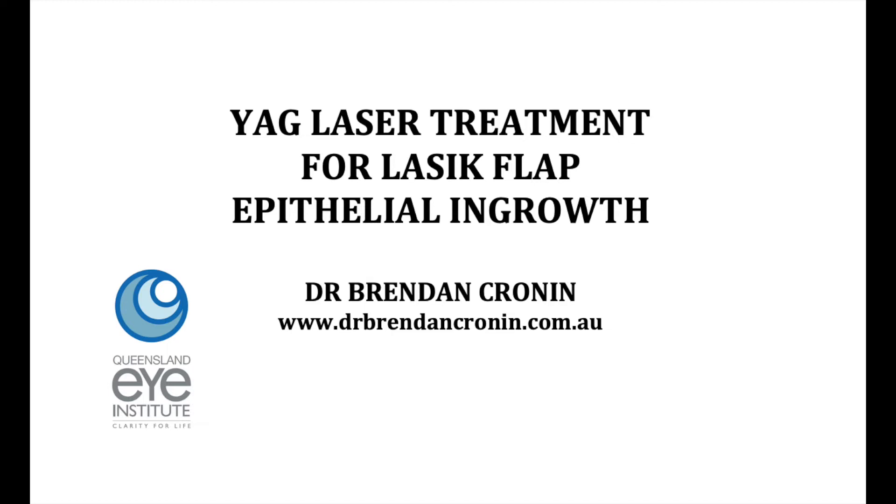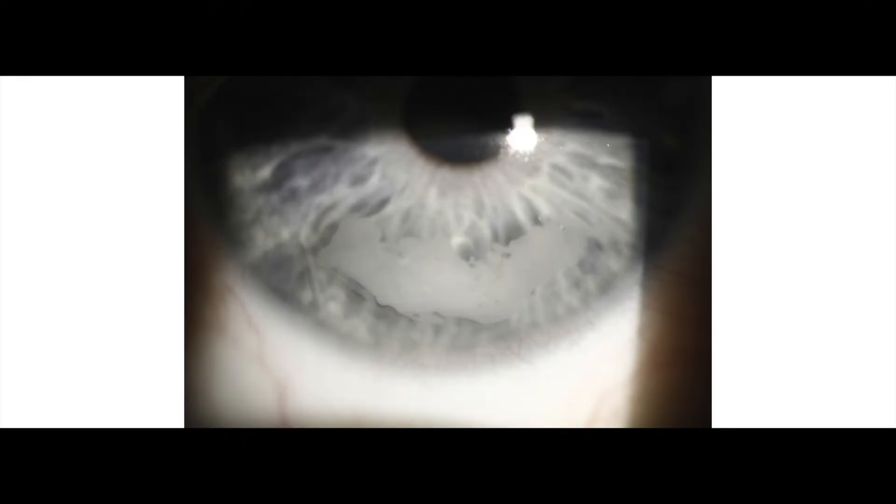In this case, the epithelial ingrowth had been there for many years, almost a decade, but the patient was starting to develop recurrent corneal erosions at the edge of the LASIK flap adjacent to the epithelial ingrowth inferiorly in the cornea.